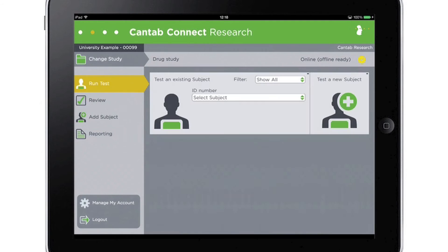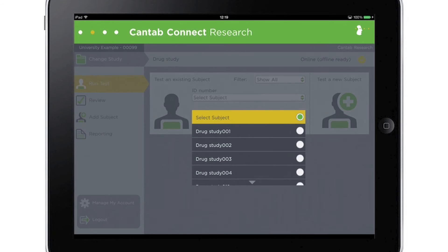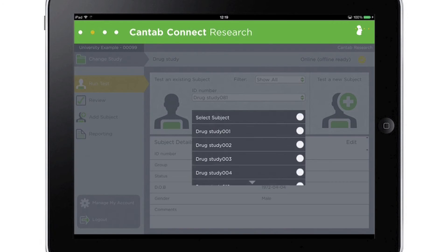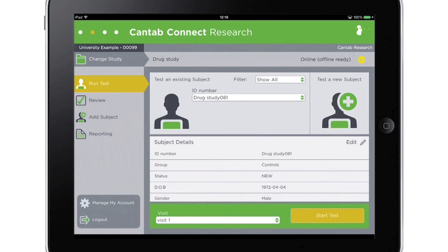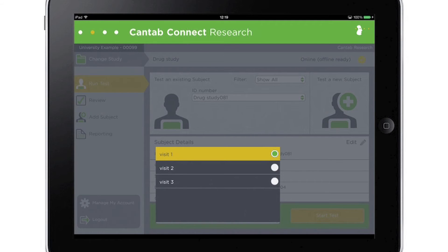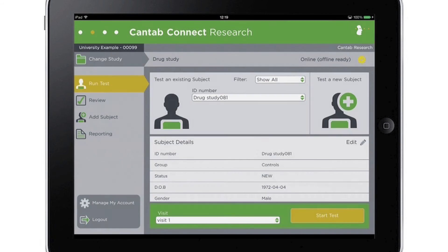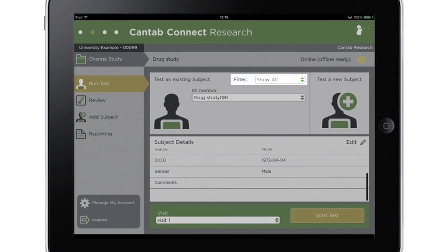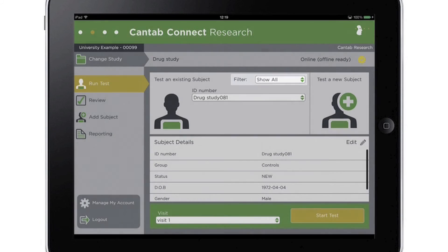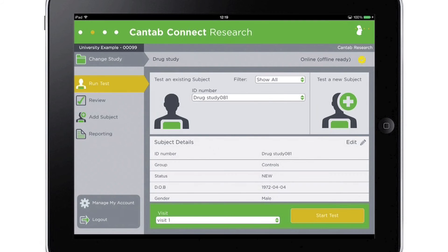Once subjects have been created, they are ready for testing. A drop-down list allows subjects to be selected if created ahead of their first visits, or to select subjects who are returning for subsequent visits. The list can also be filtered to make it easier to search for subjects in larger studies. The selected subject details will then be displayed and the testing session can begin.